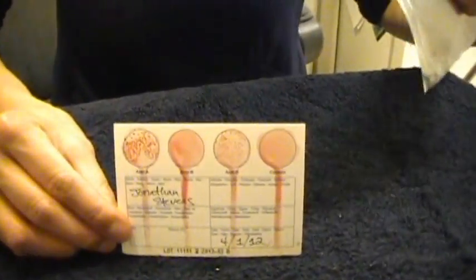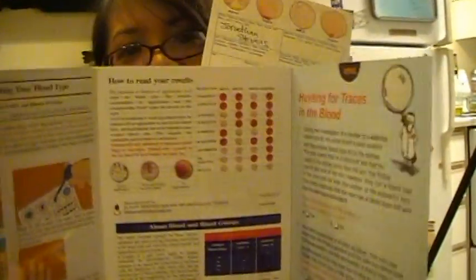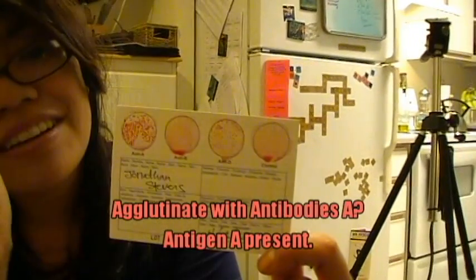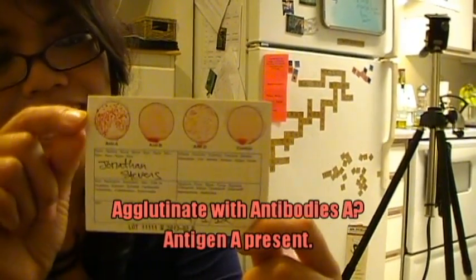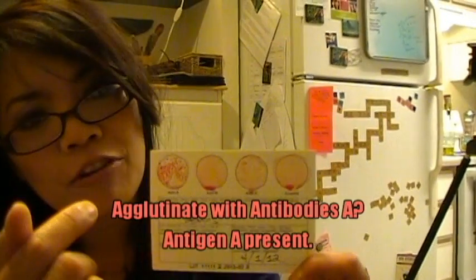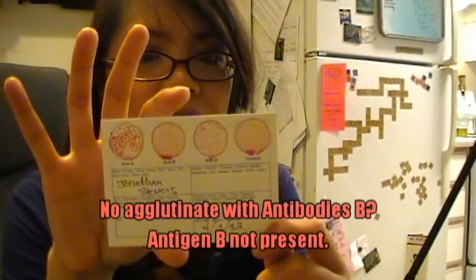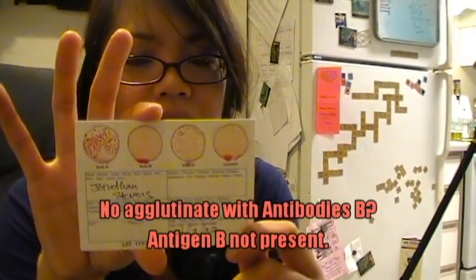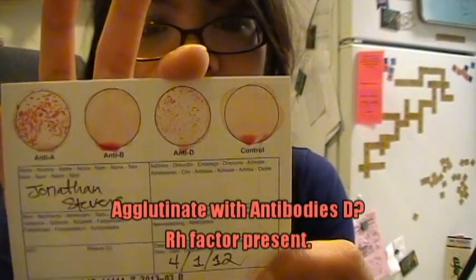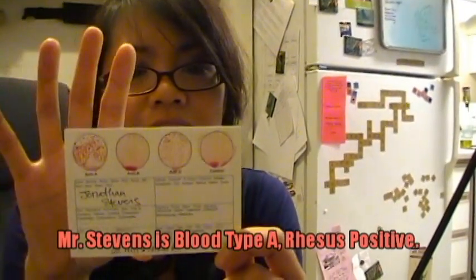It's a pretty bloody card. You could use your results paper right here, or you could be smart and figure it out yourself. This well had antibody A. Mr. Stevens' cells have antigen A — that means they clump together, so antibody A and antigen A clump together to form the agglutinate. His blood cells don't have antigen B, therefore there was no agglutinate, because nothing could combine with the antibody B. Since he is RH positive, the agglutinate occurred there. So my conclusion: Mr. Stevens' blood type is A rhesus positive.